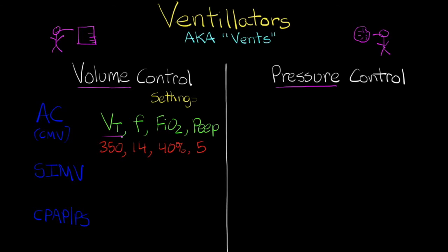If you have somebody who is 5'10" and thin, and compare them to someone else who is 5'10" and overweight, the size of the lungs for that patient doesn't change based on adipose tissue size. So when we look at ideal body weight, we calculate how much volume to give based on a patient's height, and that's the reason why.